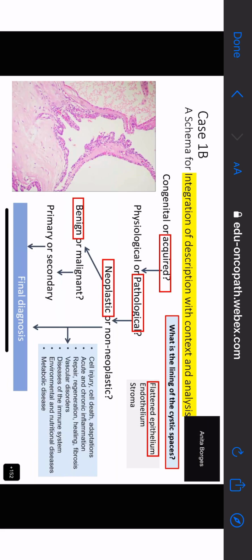What do you think? Ma'am, the clearing of the cells is due to the presence of glycogen. Glycogen. Okay. And what about you, Vimi? One has said glycogen, the other is thin mucin. What else is left, Vimi? Thin mucin. Okay.